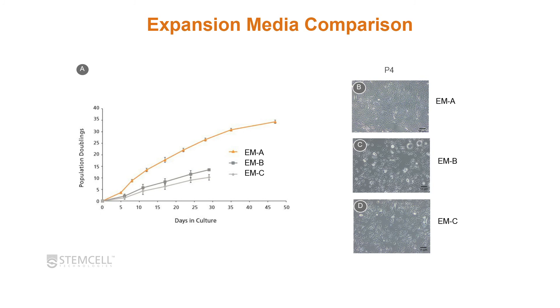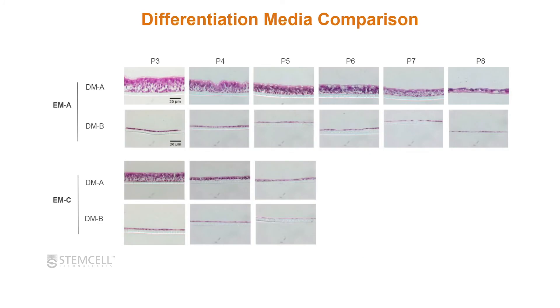Media A appears to keep cells doubling for longer than media B or C. Looking at histology sections comparing expansion media A and C with differentiation media A and B across passages P3 to P8, you can see differences as cells progress through passages. For example, with differentiation media A at P3 you see a nice tall epithelium with cilia, but by passage six or seven you see a loss of cilia and the epithelium becomes progressively shorter. These primary epithelial cells can't go on indefinitely, so you want to keep them within a good passage range.